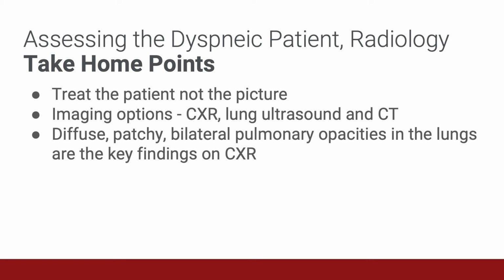Focus on stabilizing a patient first. An exact diagnosis is less important. Focus the initial testing on evaluating for life-threatening but treatable problems. Imaging can be used to suggest that a patient may have COVID-19 and may indicate that a patient has a high likelihood to get worse. Key findings on chest X-ray include diffuse bilateral patchy opacities in the lungs.